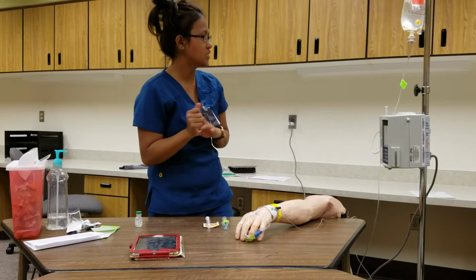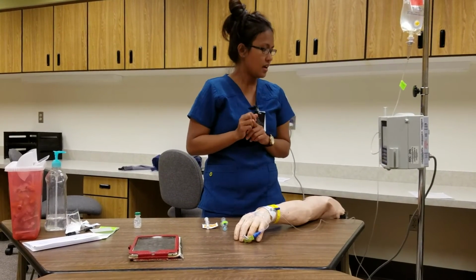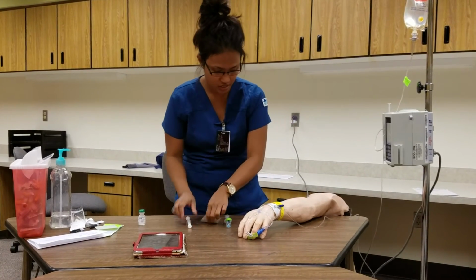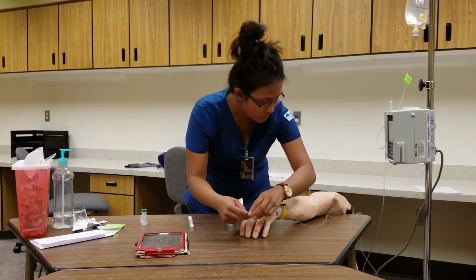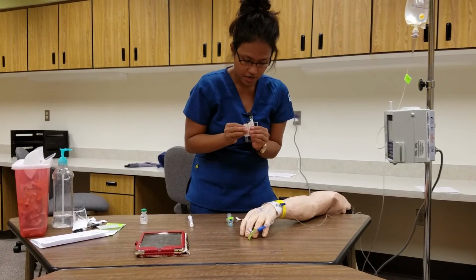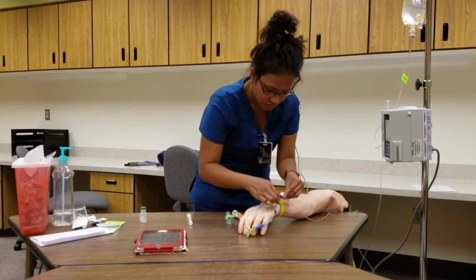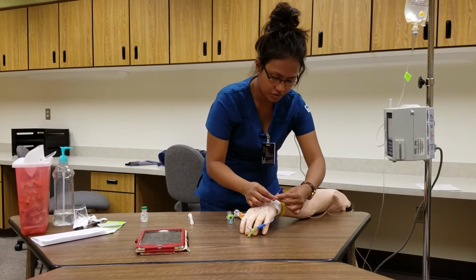Now what I want to do is stop the primary bag, and again I'm going to wash my hands, and I will be injecting the morphine now to my patient. Before doing that, I want to make sure it's not clamped. So it's not clamped, this is stopped. Alright, Miss Jones, I will be giving you some pain medication. So I'm cleaning the port for at least 15 seconds. There. Make sure I hold it.